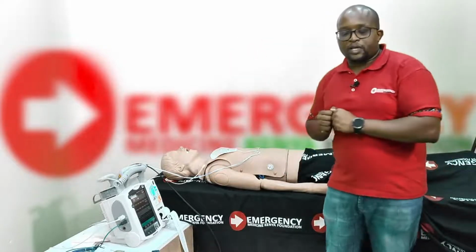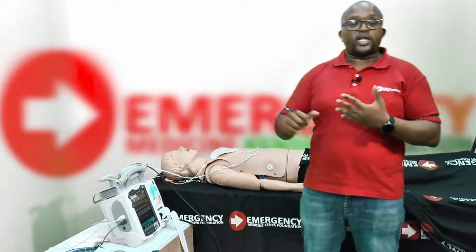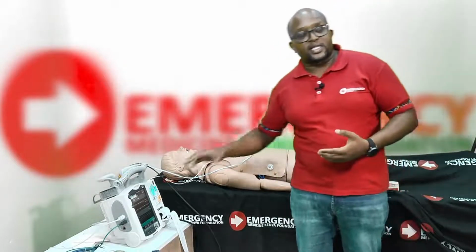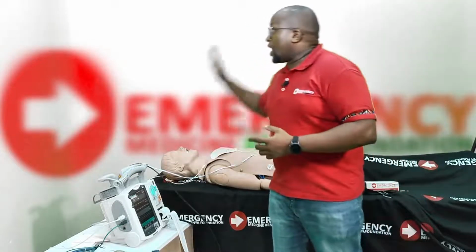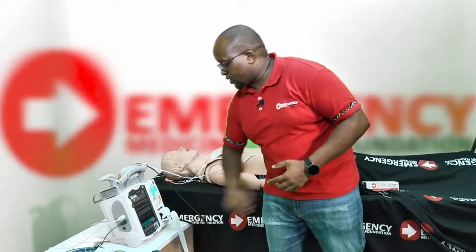Okay, and maybe at 250 to 500 mLs and check again. So it could either be a volume issue or a rate issue. Sometimes your heart rate at 70 is not achieving that cardiac output that you really want to perfuse the patient. In which case, a bit of fluid, if that's not working, I can increase the rate and maybe go to 80 beats per minute.